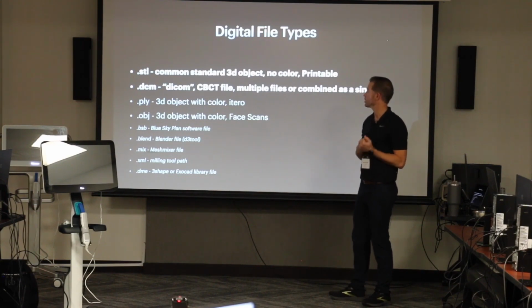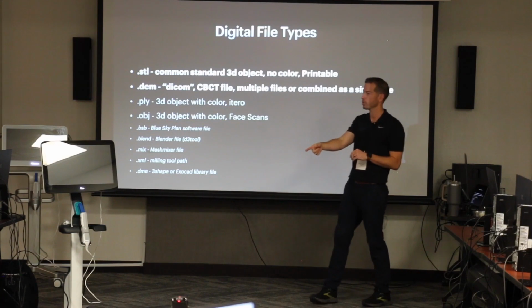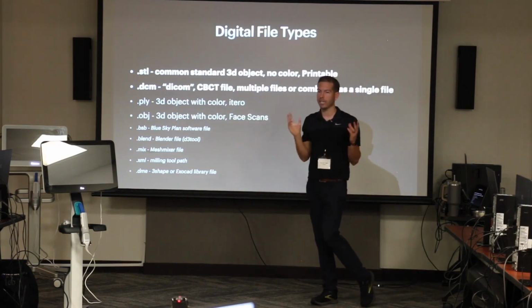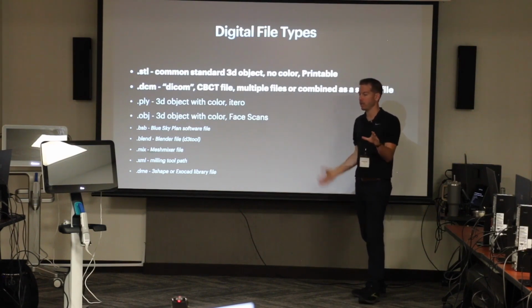So STL, this is a common standard 3D object format. This is the file that's coming in and it's a representation of the teeth. So when you have your intraoral scanner and you're scanning, it's creating an STL, and that STL gets brought in alongside the DICOM.